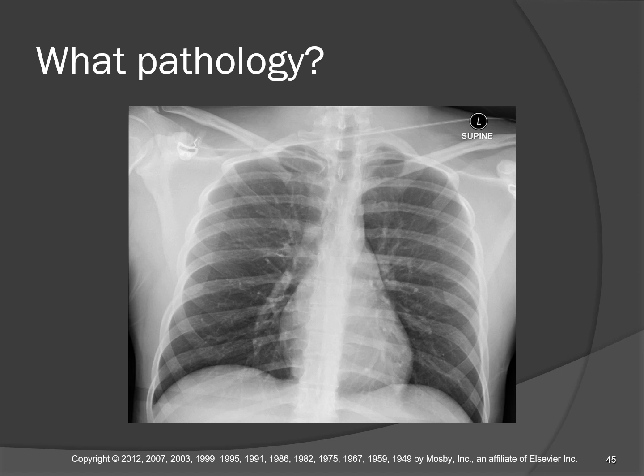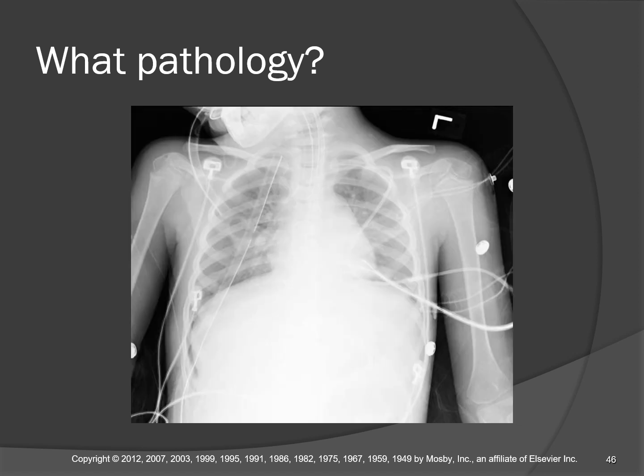The nice news is the lung is fully inflated. But that is a fracture of the sixth rib on the right side. Okay. No, I cannot see the fracture line. I just see that the rib has changed course compared to its counterparts.